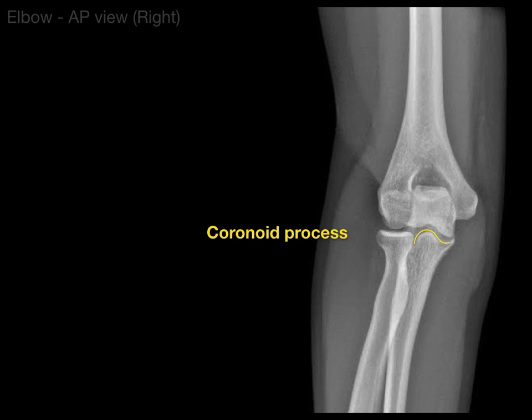The coronoid process is part of the trochlear notch — it's the front of the trochlear notch. Then there is the olecranon process, part of the ulna. What makes it tough is you've got a number of different parts of anatomy going front to back, which is why we do a lateral view as well. The olecranon process is the part of the elbow that touches the table when you put your elbows on a table. And there is the head of the radius, which looks like a wheel on its side — that's what forms the pivot joint between the radius and ulna.